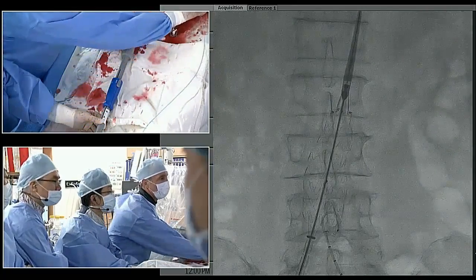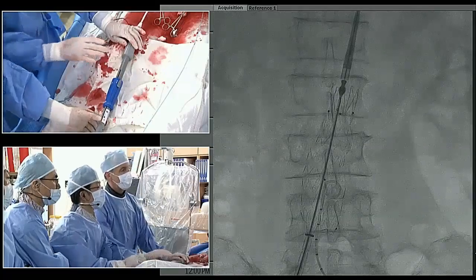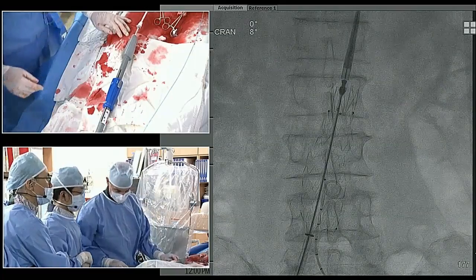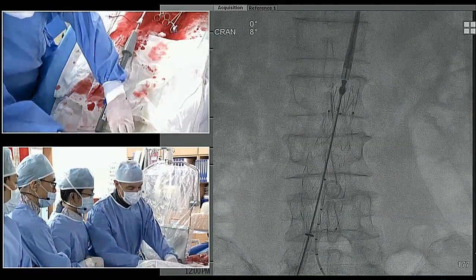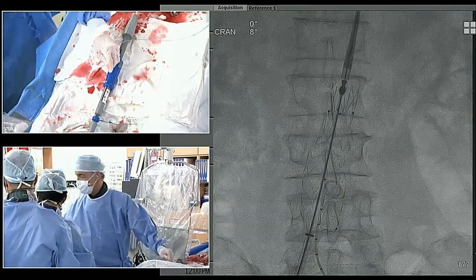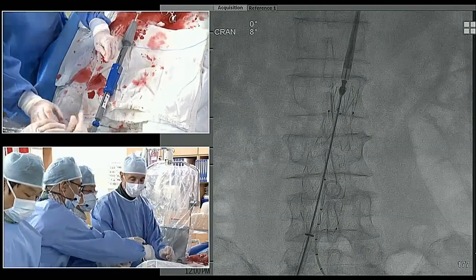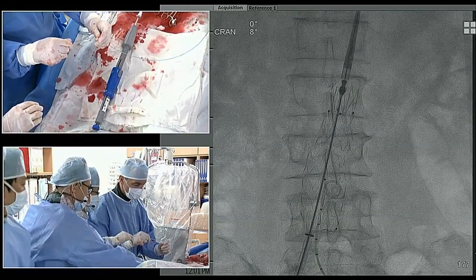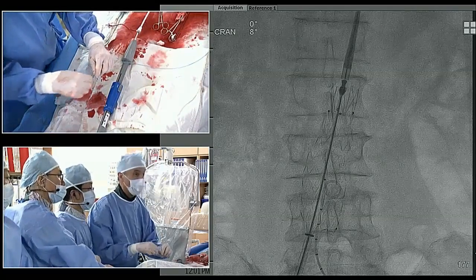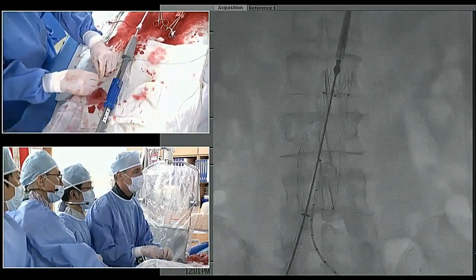Do you ever deploy the top cap before you cannulate the contralateral limb? He just did. I just did. So, thank you for that question. We'll go ahead and take this. Bob, if you want to go back to the other side, perfect. We just thought we'd give them some relief, and then we come back and show you our gate cannulation and deployment. Very well. We'll come back to you. Let's go back to the other room.